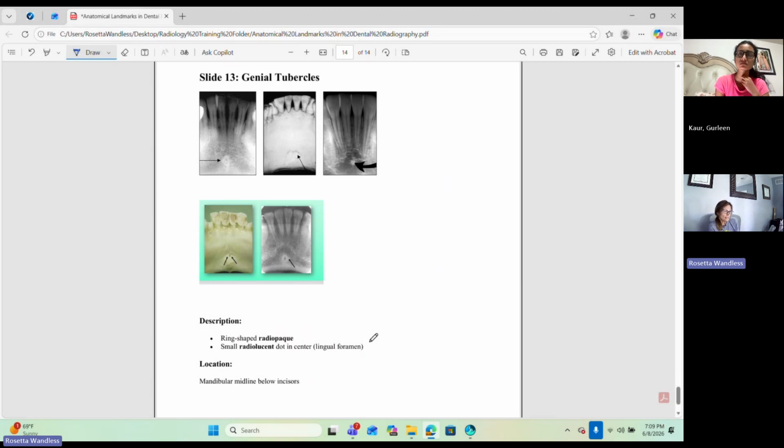With that being said, that's the anatomical landmarks. I'm going to send the PowerPoint tomorrow or Wednesday, within the next 24 hours, for the Thursday chapter, which is going to start the more detailed part of taking a full mouth set of x-rays. Where do we place it? What are the rules and techniques we're going to use? It's the biggest part of the chapter. It'll take us a couple of days to get through it. Do you have any questions about this before I go on?